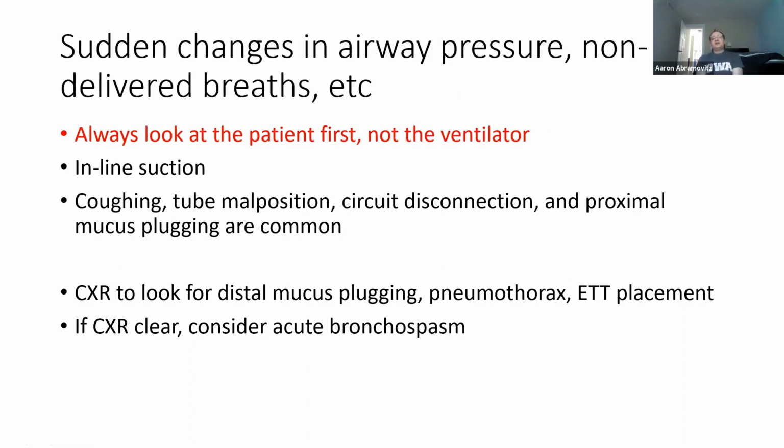If you have sudden changes in airway pressure or non-delivered breaths, then the ventilator is just alarming and not delivering any breaths. This is a pretty common call. Always look at the patient first and not the ventilator. It's amazing how many times I've been called into a room, people are freaking out, they're all looking at the ventilator, and the ventilator is disconnected from the endotracheal tube.